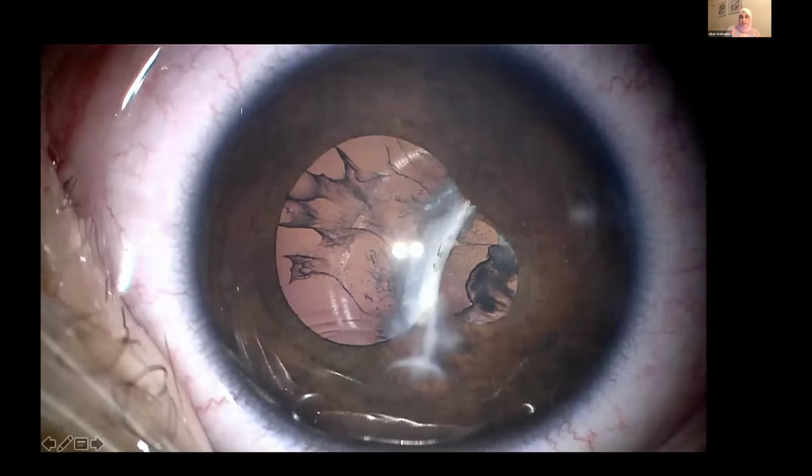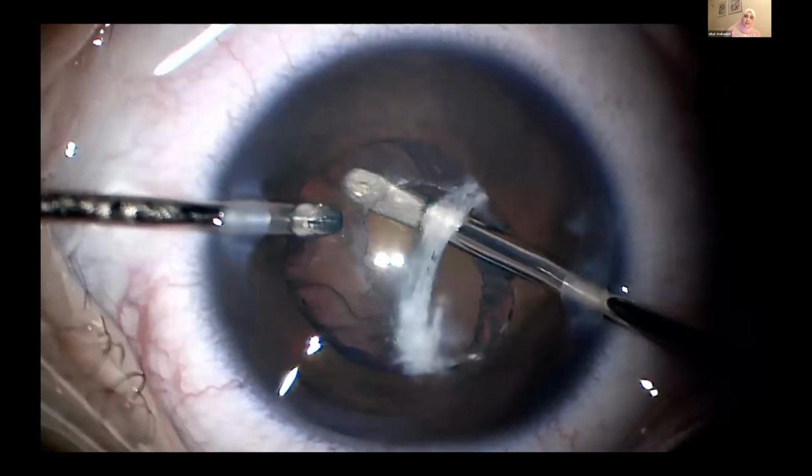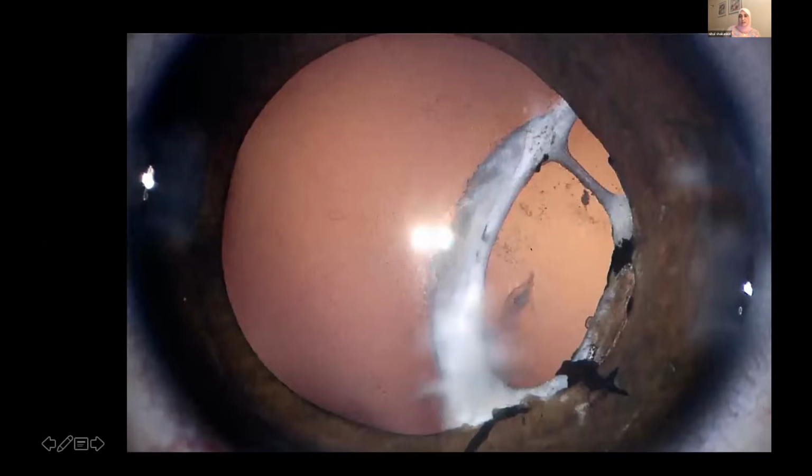Sometimes with a peripheral defect like this, you can see the whole edge of the defect. It's a sort of paracentral defect in the anterior capsule. How to deal with it? We first inject viscoelastic inside the capsular bag in order to facilitate aspiration of the remnants of the cortex. And we have here the defect with a fibrotic edge.